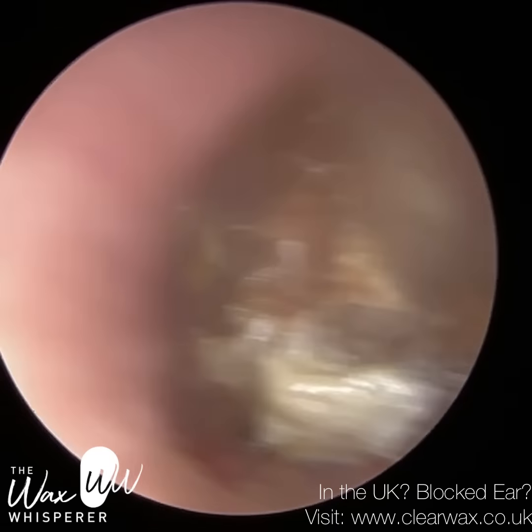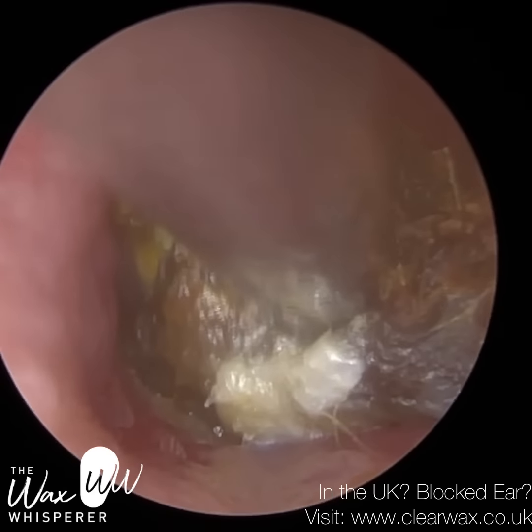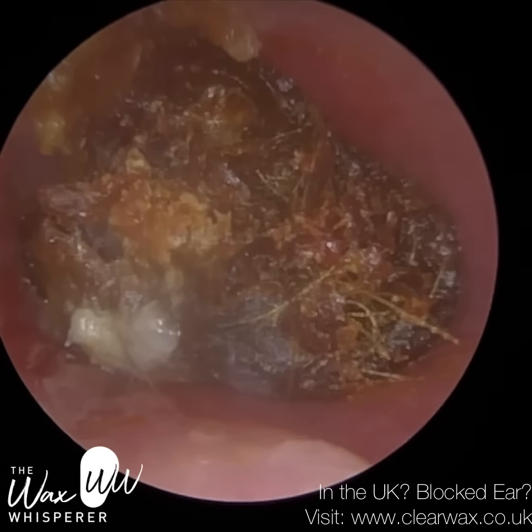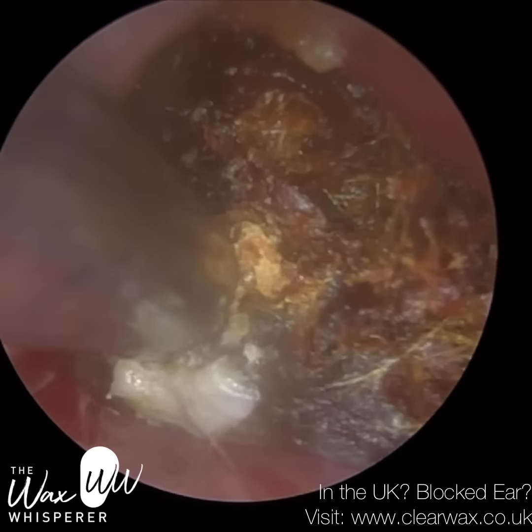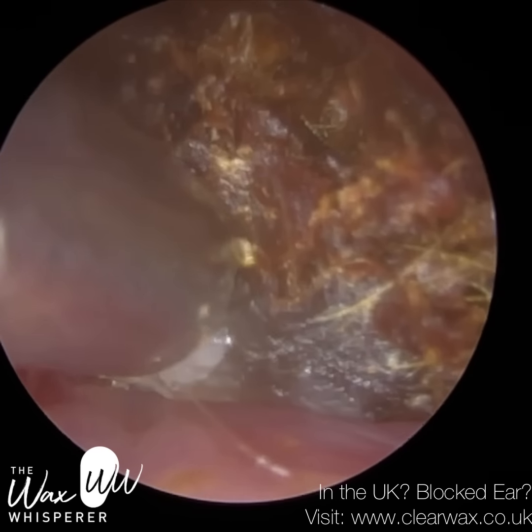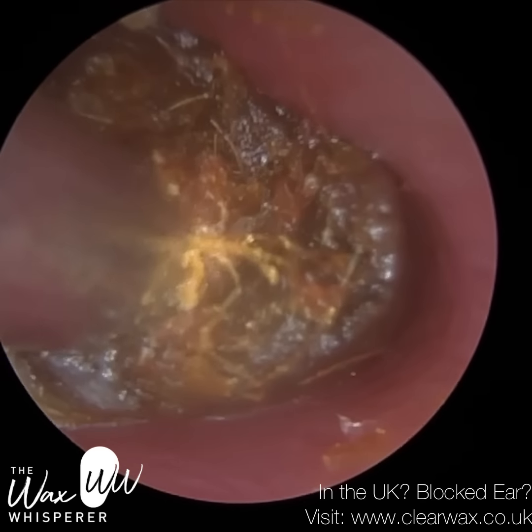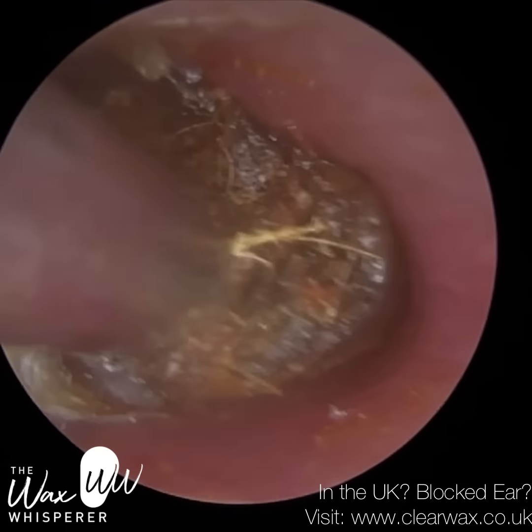of keratin. And you can begin to see the widening of the ear canal now, where on the left-hand side of the canal wall, you can see it's red. So it's red because that skin that I just removed was attached to the canal wall. You can see it's the same location, same size as two white patches of dead skin just below the suction probe. That was on the canal wall to the left where it's red. So the pure motion of bringing it away has just caused a bit of redness in the ear canal. But that plug was pushed up against the canal wall in that region as well. So it's compressing and expanding it.